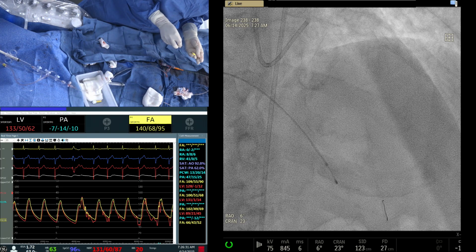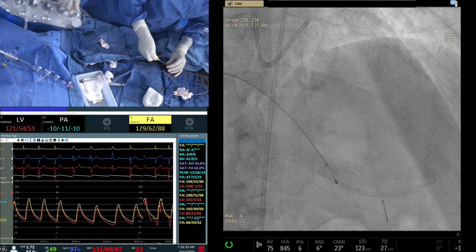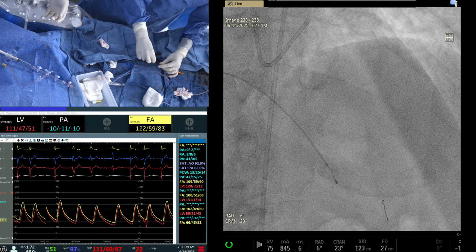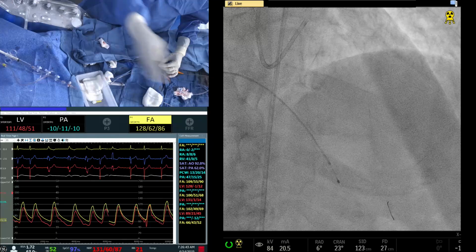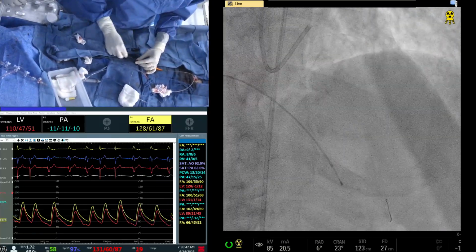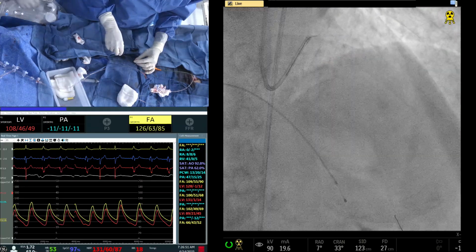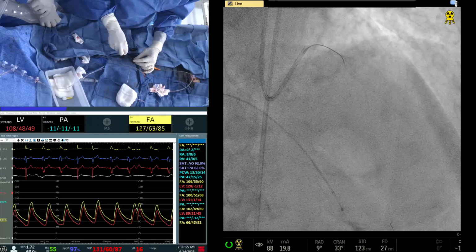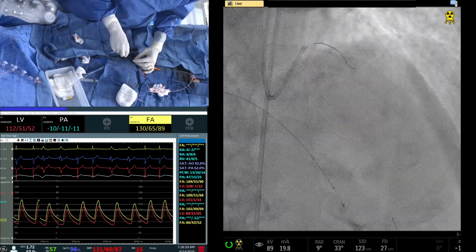Now getting the second burr happens in maybe 2% of cases in our lab. We do 65 rota per month, maybe 2 cases, because now everybody is getting the IVL or cutting balloon. The way the 1.5 burr crosses, sir, maybe a 1.75 will be good. We have all been trained by you, so we think that probably we'll use a second burr. It is more cost effective also in comparison to that.